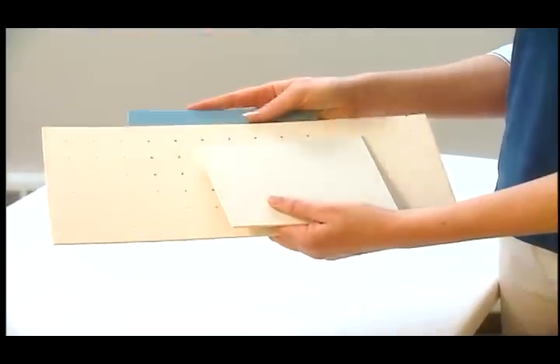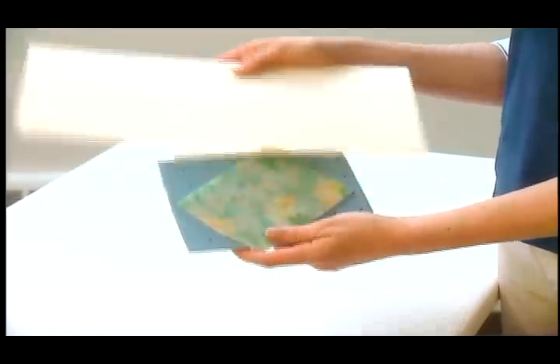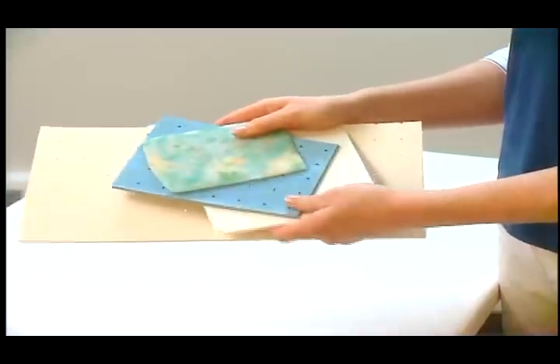There are many considerations when deciding on the design of a splint. Please refer to your text for questions that will guide your decision-making process. Selecting the proper material is important because it can affect your splint design. Becoming familiar with the properties of various thermoplastics will help you choose the best material based on the needs of the patient and the purpose of the splint.